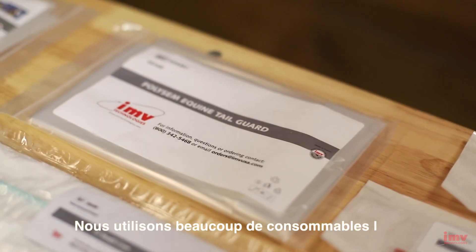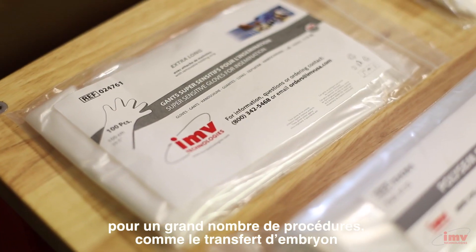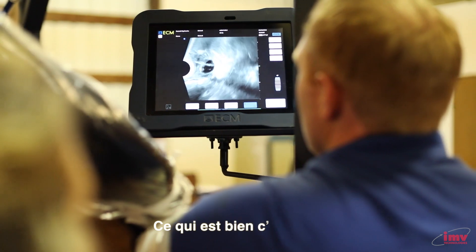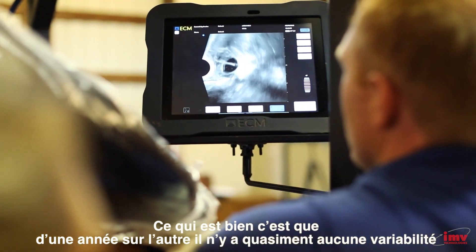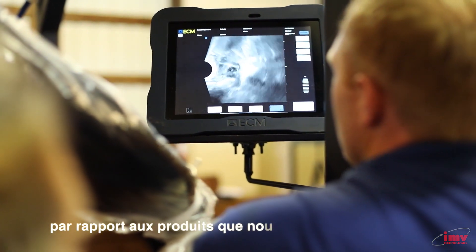We utilize a lot of IMV consumables for many of our procedures, especially for the embryo transfer process, due to the fact that they've had a long reputation in the equine reproduction industry for providing high quality and very consistent products. Year to year, there's almost no variability in the product we got last year compared to this year.